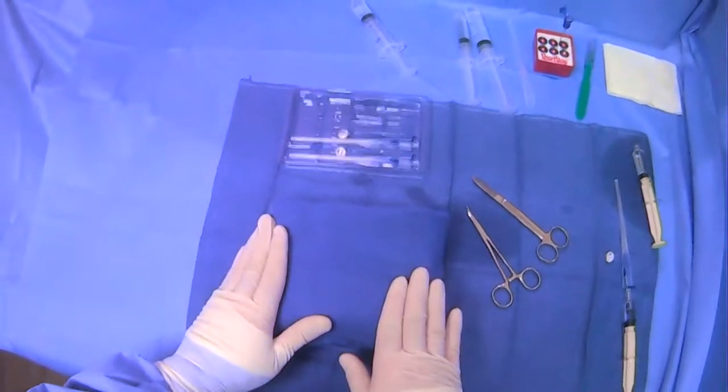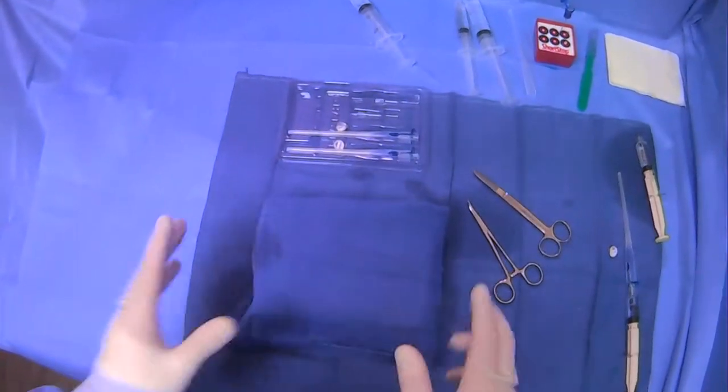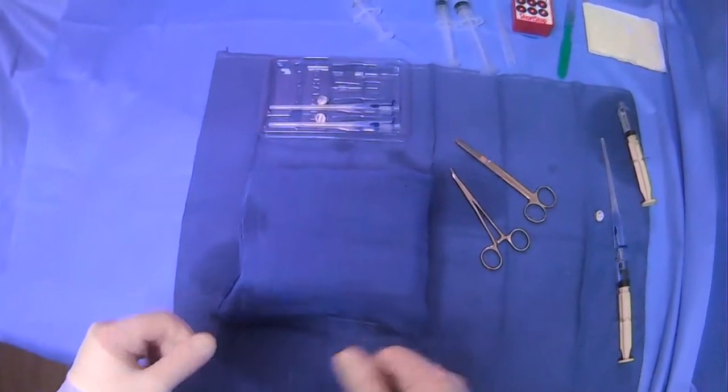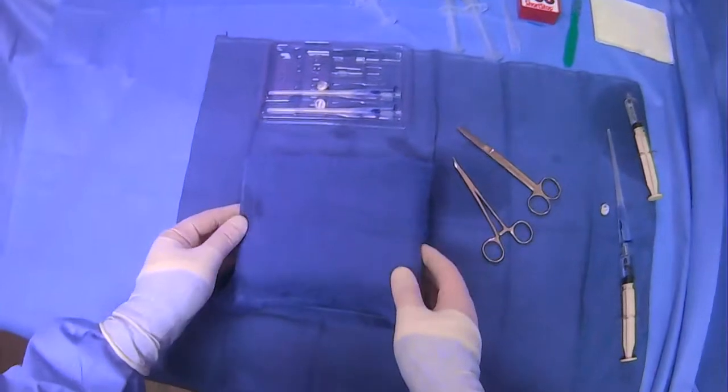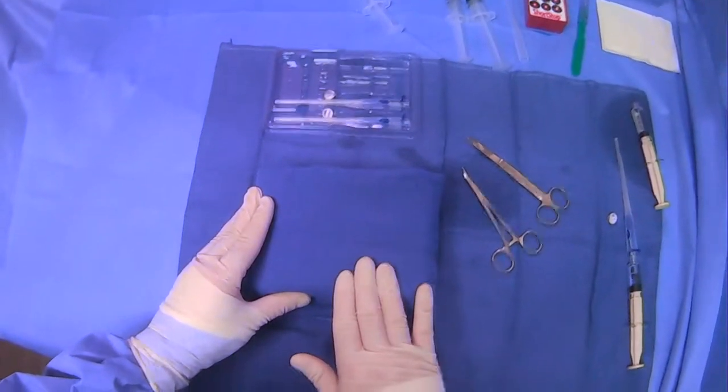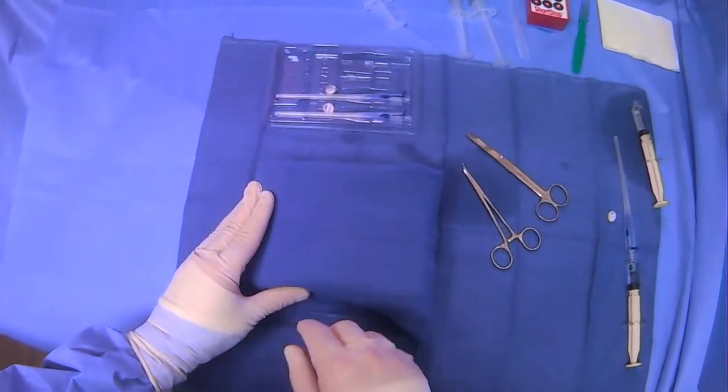Okay, now we're going to do a little demonstration to show how the T-Fastener system works, and something that's a little bit more representative of what we would do during a case. So let's say this is our area of the abdomen where we're going to be going into the stomach.